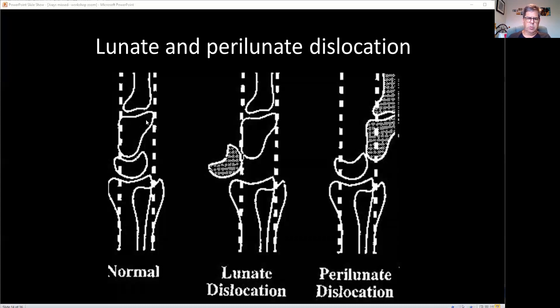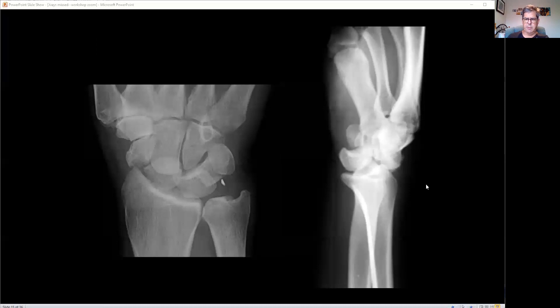You also hear about the trans-scaphoid perilunate dislocation. That is where the lunate stays in position but everything else goes back. Because of the forces, you tend to fracture through the scaphoid bone — so you get a trans-scaphoid perilunate dislocation. Here's an example: on the lateral, there's the lunate and it's actually in position, and the rest of the carpus has gone back. On the way through, it's fractured through the scaphoid. These are nasty injuries — they go to theatre to get back into position and everything screwed back together.